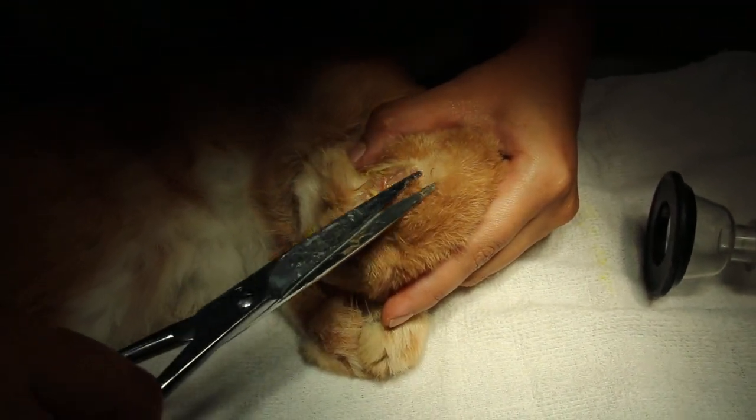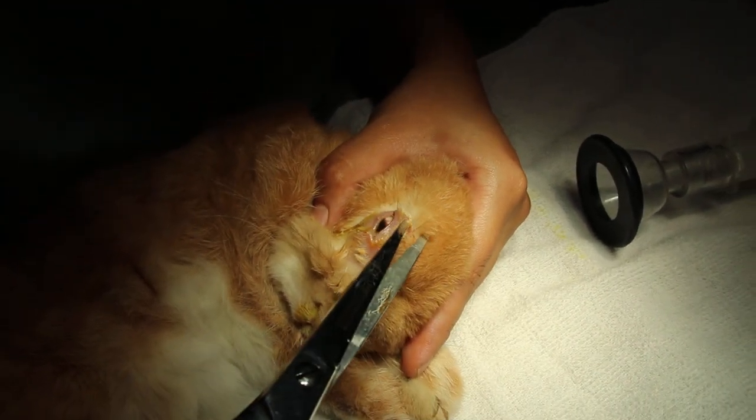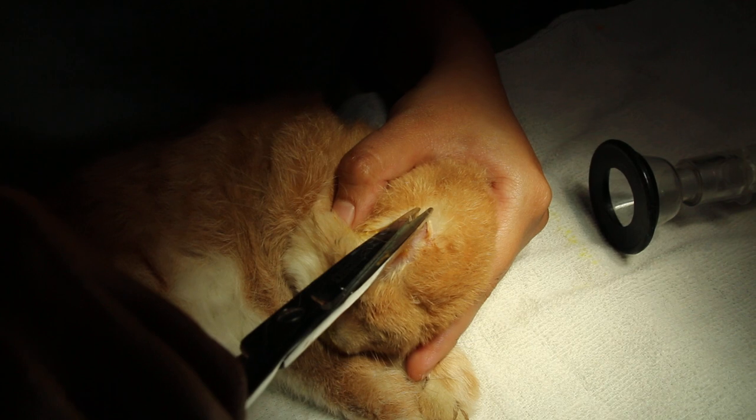We are using the tip to cut the eyelashes. This rabbit has eye discharge for the last three days, only the right eye. Now you have to cut the long eyelashes slowly. Cut it off.